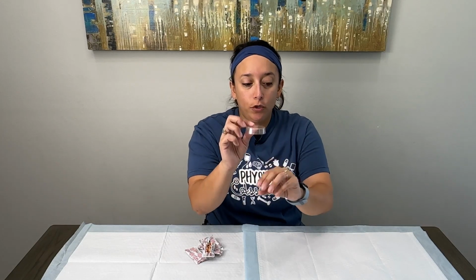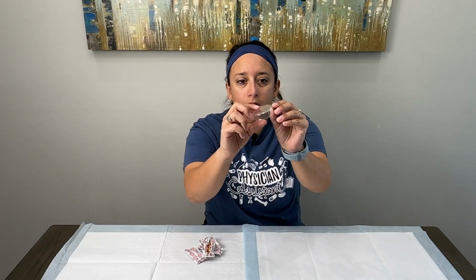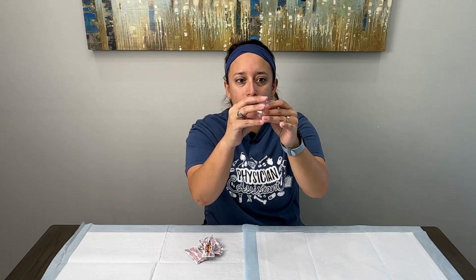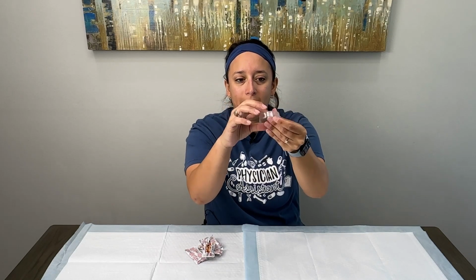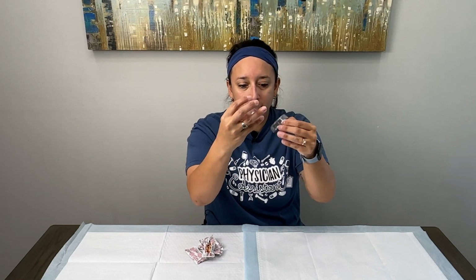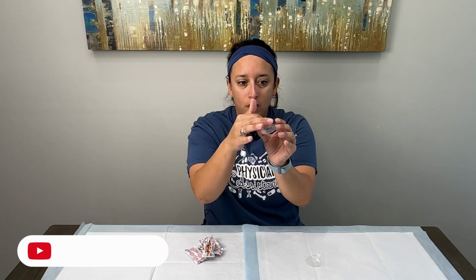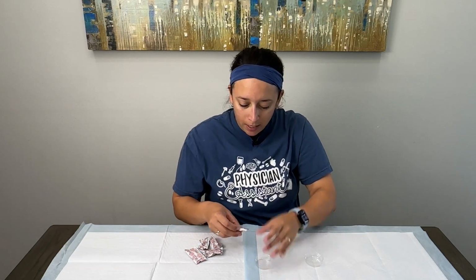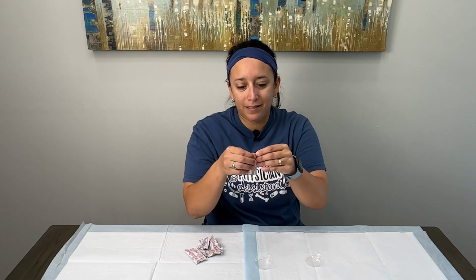First, we're going to take two of our little milk caps and we're going to separate them. We have two that will fit on top of each other like this and create that nail bed. So we'll take those out, separate them, and then I'm going to deal with just one where I'm going to put my ketchup. So I'm going to set that down right here, and I'm going to grab one of my ketchup packets.